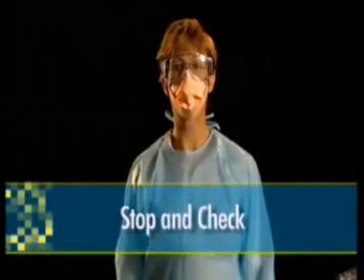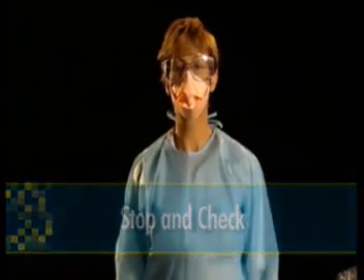Remember, it is important that you do not adjust your mask or protective eyewear, or touch your face whilst in the containment area. For this reason, you should stop, take time, and check that everything is in place and you are feeling reasonably comfortable before entering.